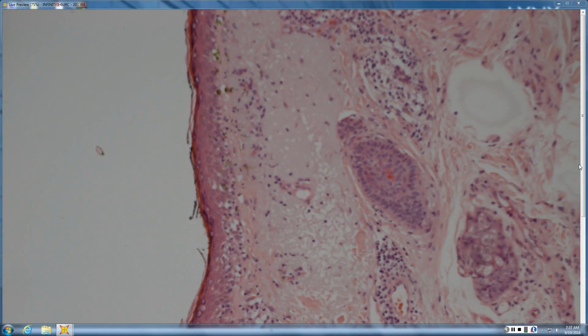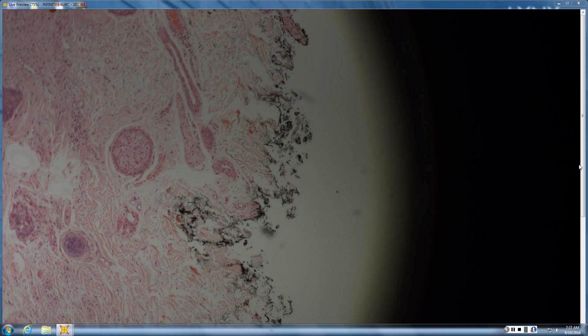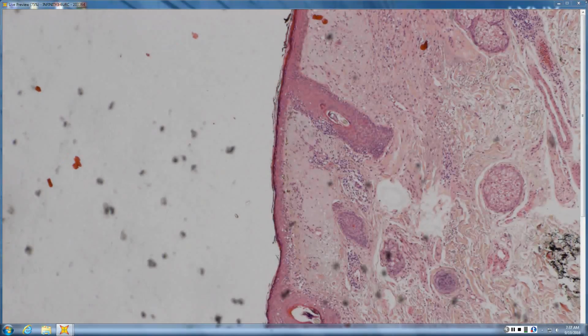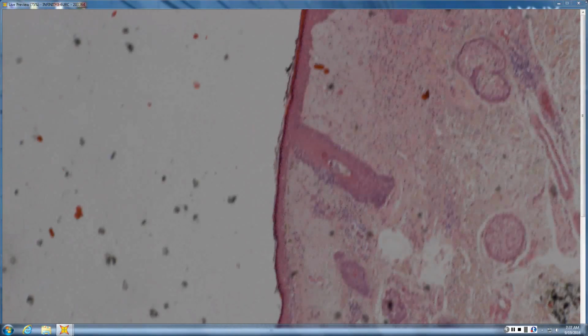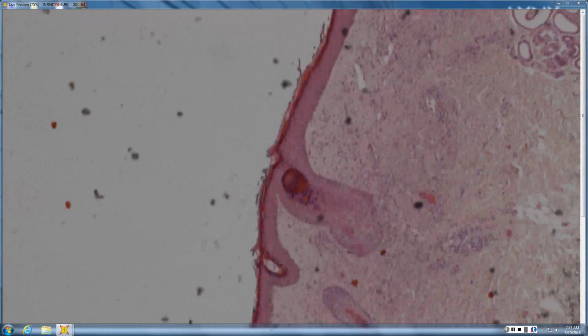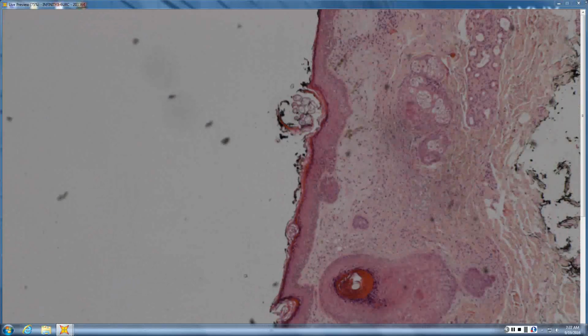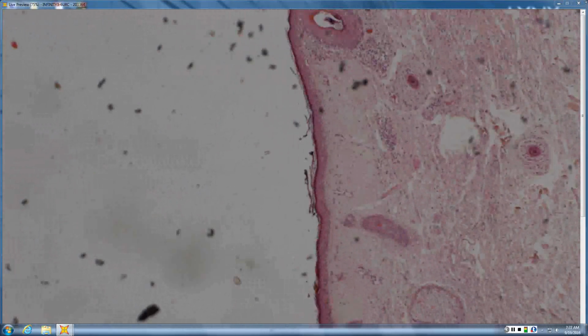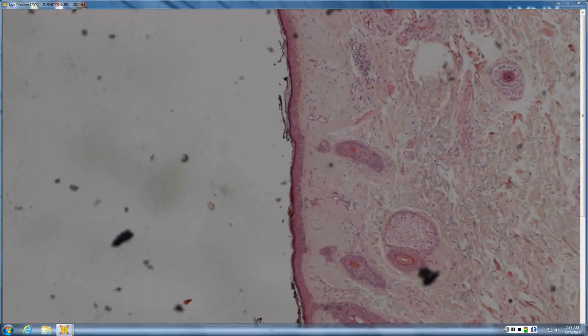So we're on a hair-bearing area. Looks like I see some sebaceous glands. So maybe some. Let's see. So is this like lichenoid regression? Well, someone certainly took a big chunk of somebody's face, right? So they were probably after big game.